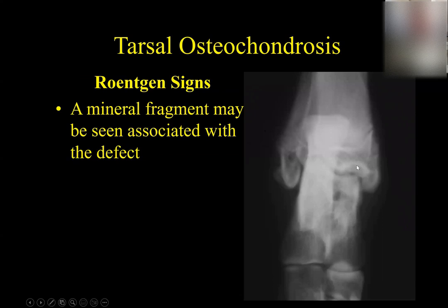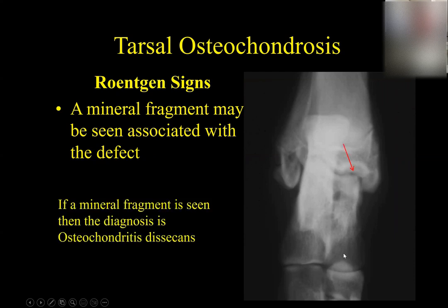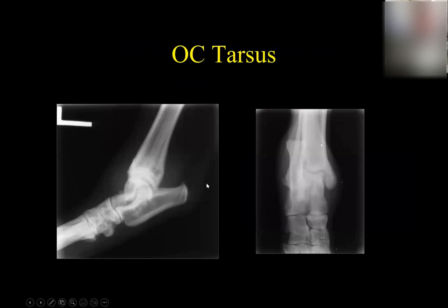Okay, here's another example. So here, now I can read through that calcaneus, this side here, the lateral trochlear ridge of the talus, and that joint space looks nice, it's congruent. But I come over here and now it's widened in appearance and I get this little focal concavity associated with the medial trochlear ridge of the talus, osteochondrosis. Okay. This one's kind of a weird one here, and you can do a special view, but you can actually see the lesion here. In this case, now it's on the distal end of the tibia on the lateral aspect. So now I got this subchondral bone defect right in here. And again, that's another example of a little bit of an oddly placed osteochondrosis lesion.